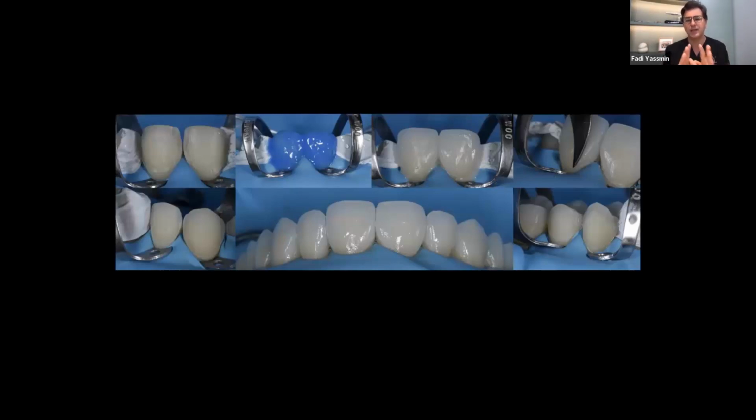And from there, your ceramicist and CAD technician can mill exactly without ruining the textures, because these beautiful files come with very, very natural textures. As a result, you're able to get a beautiful replication of a true texture for the teeth. So by being able to reproduce that, we can actually produce that in the final ceramic.